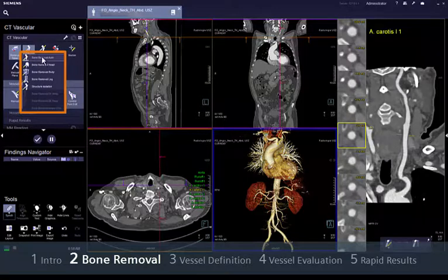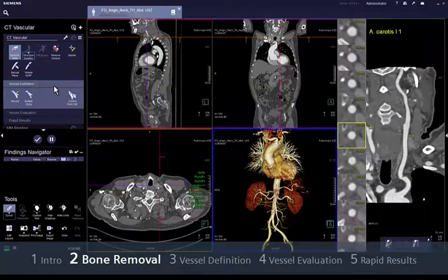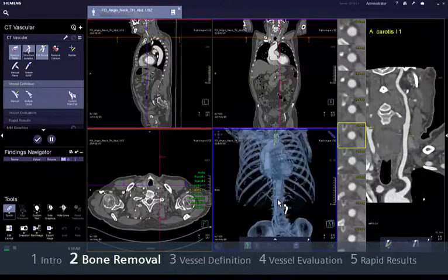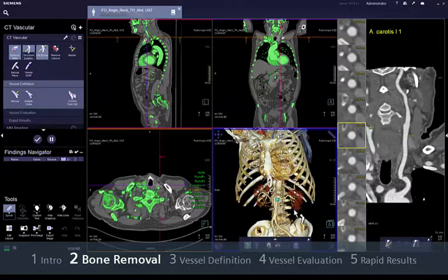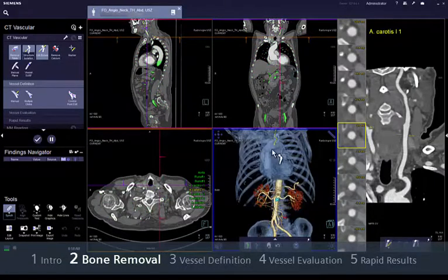In case of suboptimal results, you can also switch between algorithms using, for example, the Structure Isolation mode, if you want to start a user-defined bone mask from scratch, defining the areas to mask or unmask as in the Edit Bone Removal mode.